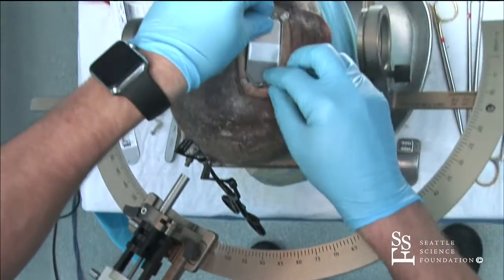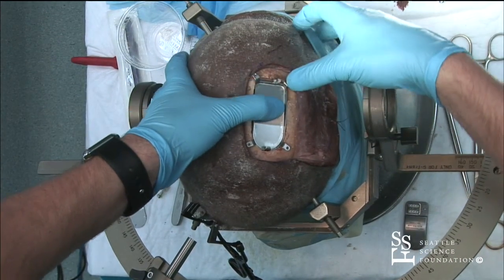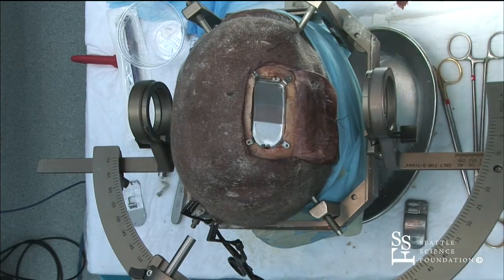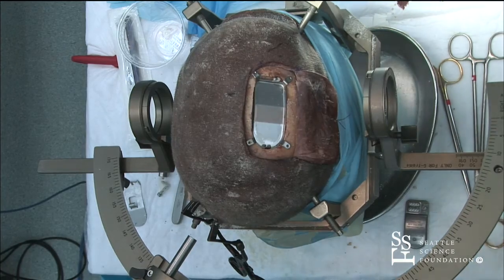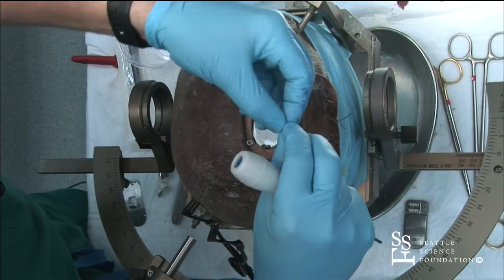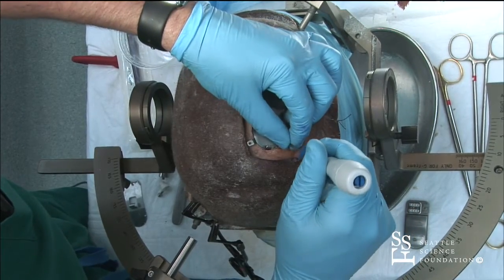So then we want to put it in. Not exactly perfect, but. And then we'll screw these down. I'll just do one.